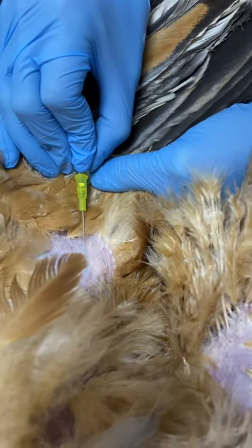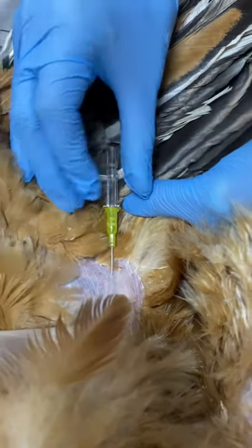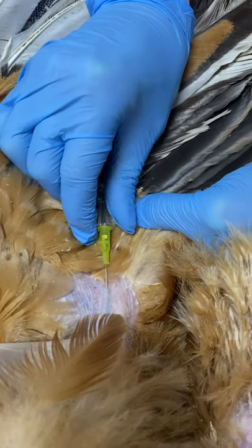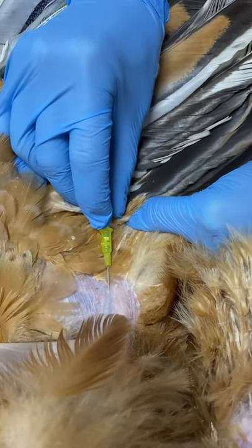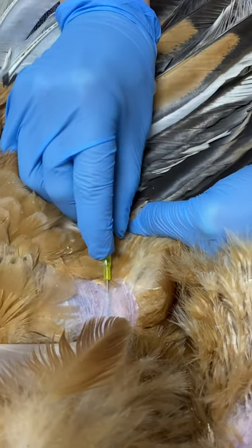You want to stay nice and shallow. We'll have already prepped the skin with some alcohol. We stay nice and shallow, and once we get flashback we can then advance that catheter. There we go. Perfect. Brilliant.